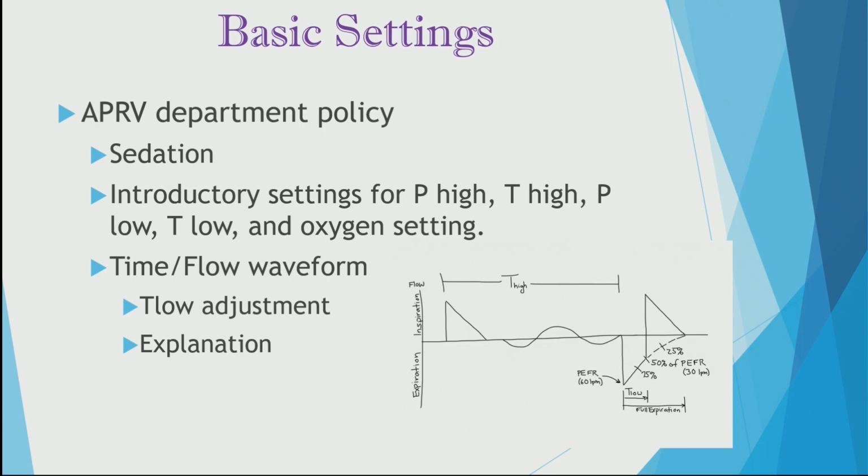I know you may have questions. That's fine. No problem there. Because if you're anything like I am, then you need hands-on practice. So, contact me. Ask your questions. We can get a ventilator out. We can look at this, whatever, to help you with this process. But you don't want to lose all the alveoli you recruited.